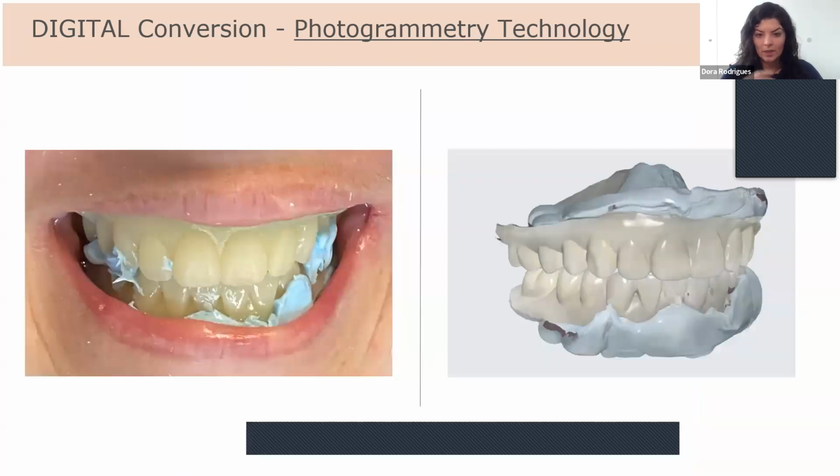So again, we use the dentures, we do a wash with both dentures and a bite. The really good thing about this is that you can confirm with that denture if the bite, the vertical, is too open, if it should close, if it's showing too much pink or not, depending on how severe the case was, if the patient had teeth or not, and whatever changes you did on your planning.